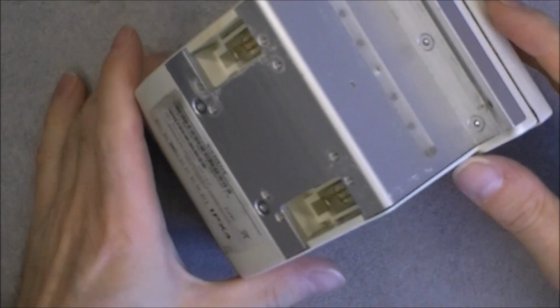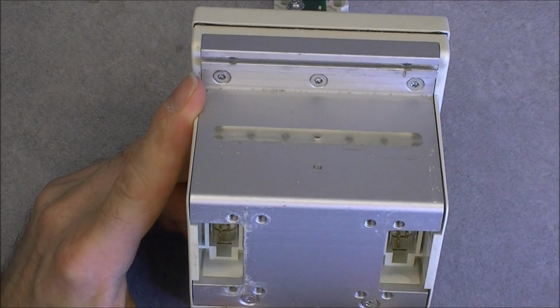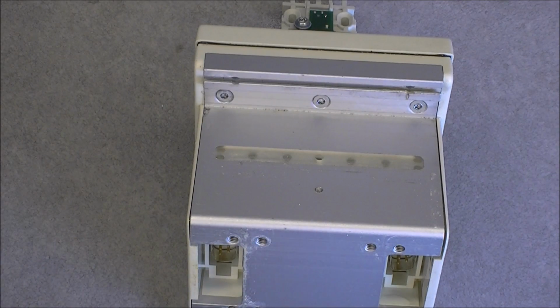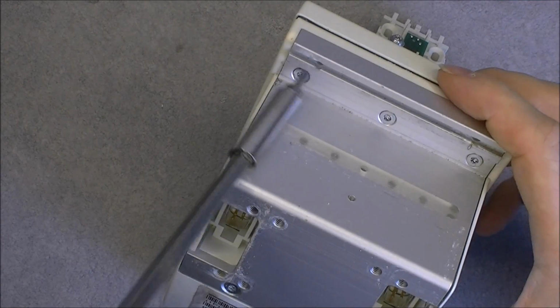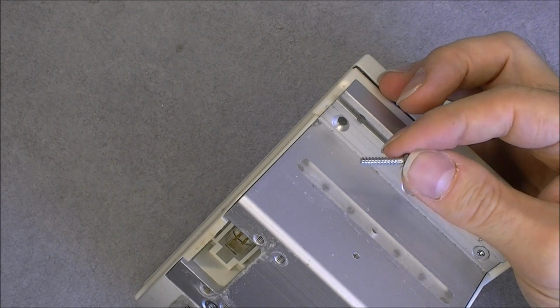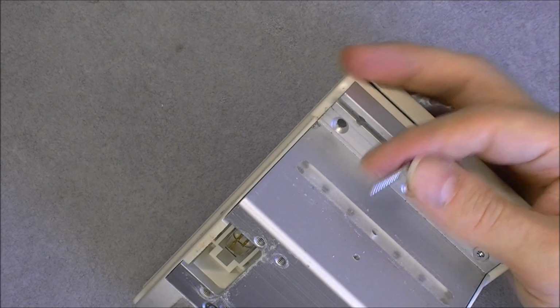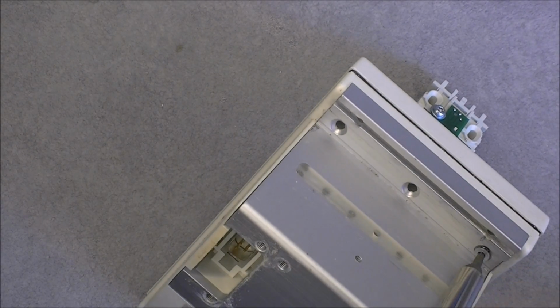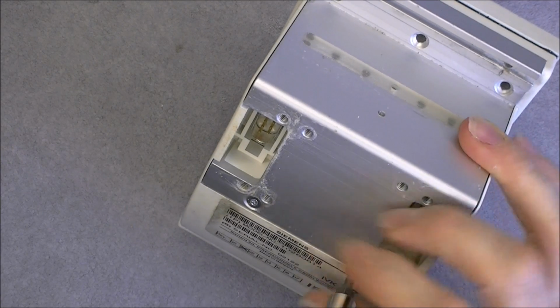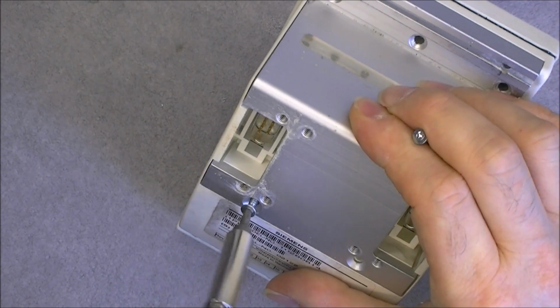So now we can remove this bottom plate, this aluminium plate. On some of the controllers there is a mix of Torx, Phillips and posi-drive screws, and the posi-drive screws are really crappy. They are really not working well. But the Torx are alright. And as you can see, yes, they are self-tapping taper screws. So it means we have no metal inserts in the plastic. A little bit of a disappointment considering the price of this thing. It is $4,000. So this aluminium piece is some extruded aluminium that will just come off like this. Two little extra screws here.